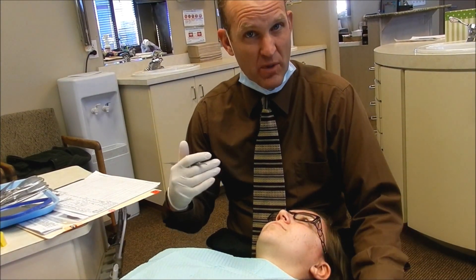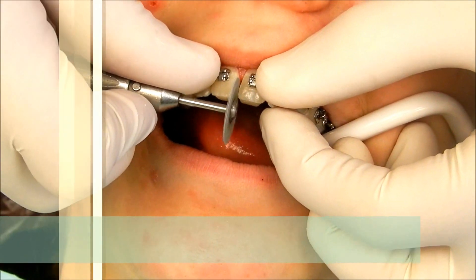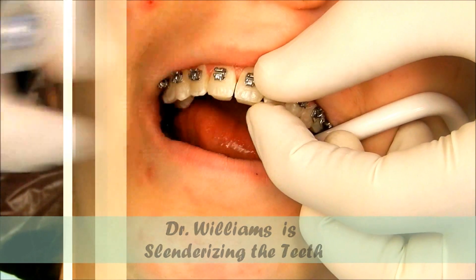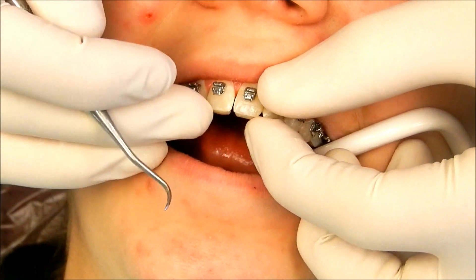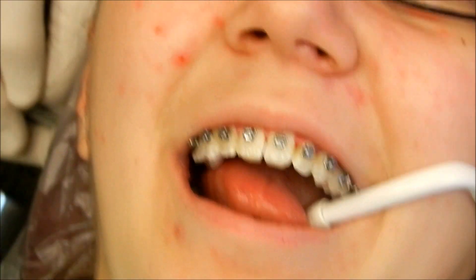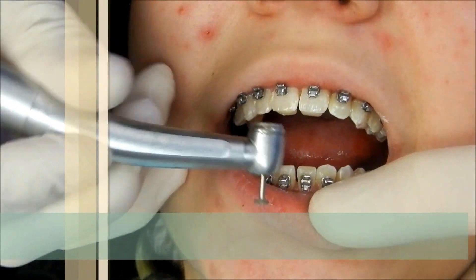What we're going to do today is some interproximal reduction — basically polishing of the teeth. We're going to space the teeth just like this, and then as we close, see how that gap gets smaller right there. The gap is a lot smaller as we close, and it'll close that next month. That's how we slenderize your teeth.